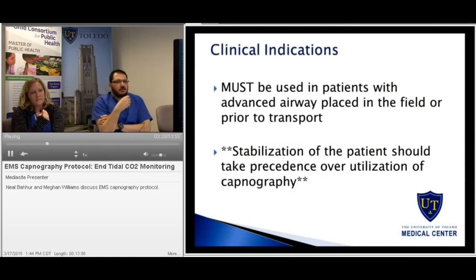Thank you, Megan. A few words on clinical indications. First thing important to remember is that the device must be used in patients with advanced airways placed in the field or prior to transportation, as well as please remember that stabilizing the patient is the most important thing. Implementation of capnography is secondary after the patient is stabilized.